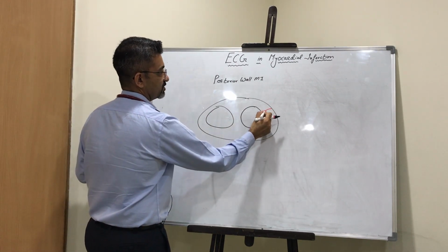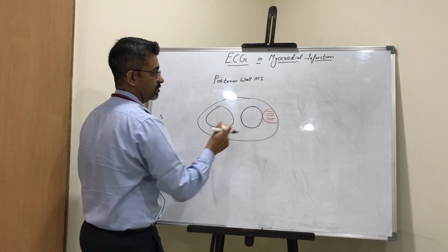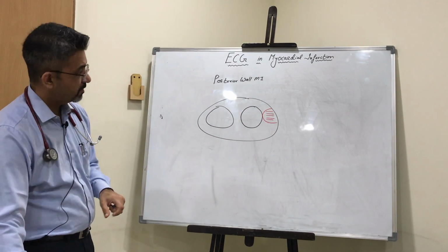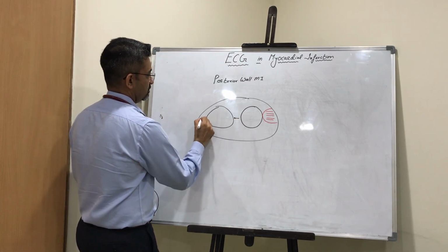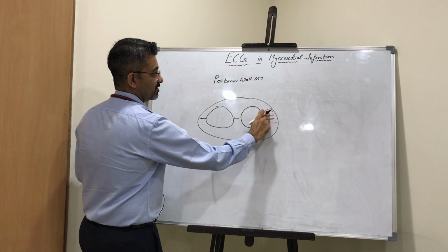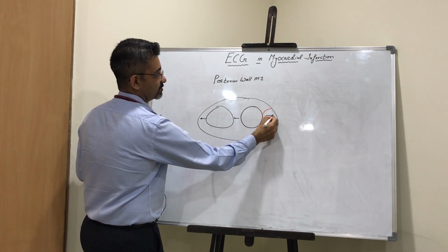Suppose I have an infarction here, right? The current is like this. If I did not have an infarction, the current was like this.